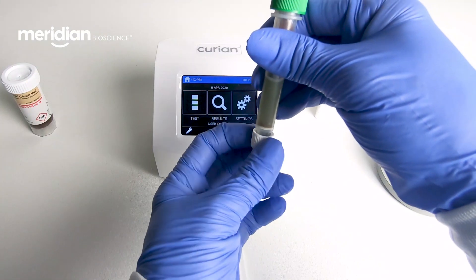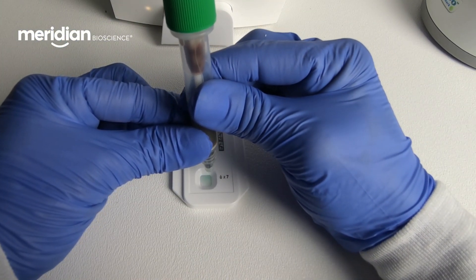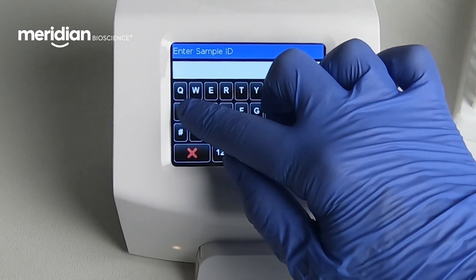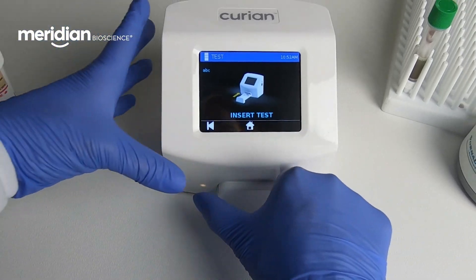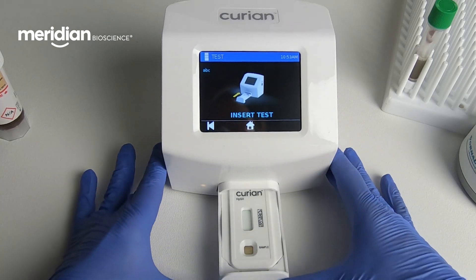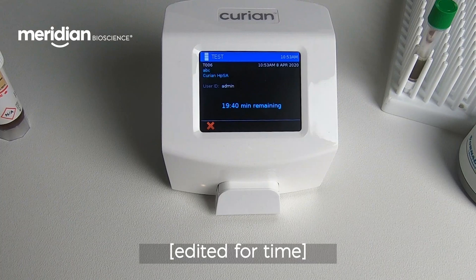Squeeze seven drops into the sample port of the test card. On the Curian, click Test, Incubate and Analyze, enter your sample ID, insert the test, and notice how easy and intuitive it is to navigate the Curian user interface.